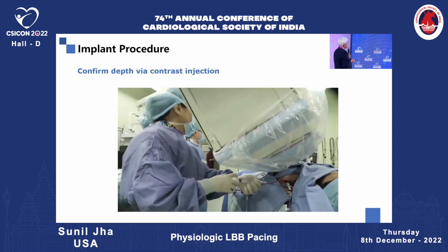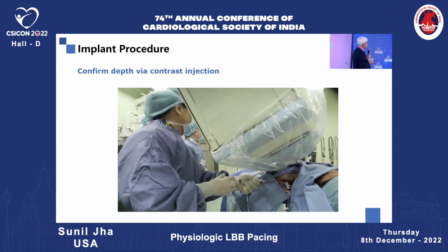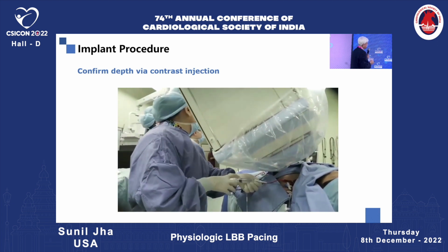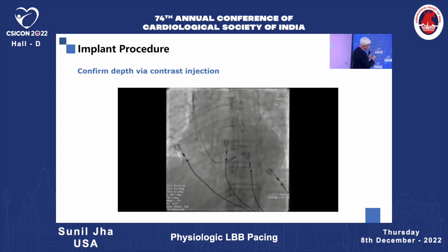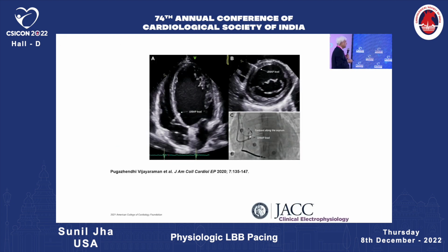Okay, so how do you confirm the depth? We don't do it routinely, but just to show that your left bundle branch lead tip is there, and then your dye is on the right side. That distance will also confirm that. You can do the echocardiogram.